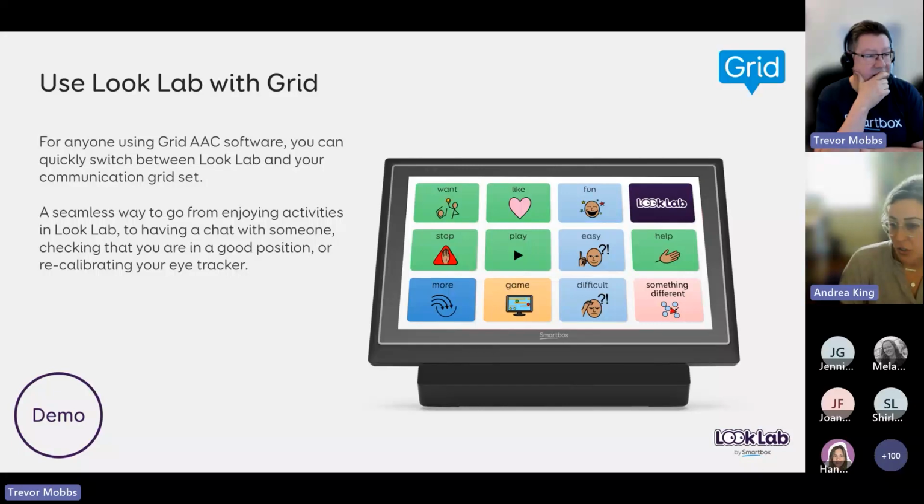There are some vision concerns. It's been reported that the user has difficulty visually with too much stimuli, but we don't necessarily have a diagnosis right now. It's been recommended that the user have a high contrast color scheme, and they're still working with their communication partner on getting to know their device. So we're going to talk about why we're going to choose the settings that we've worked with, and what options there are that could best fit this user.